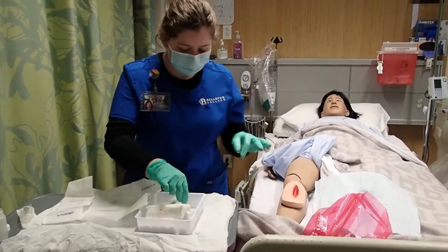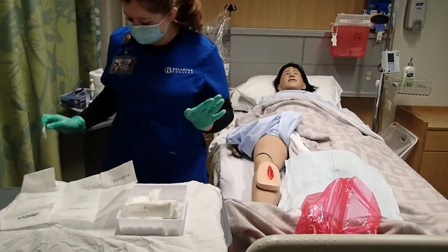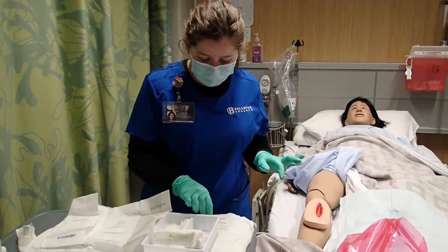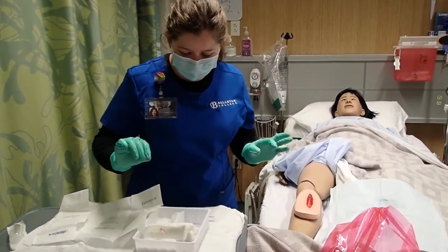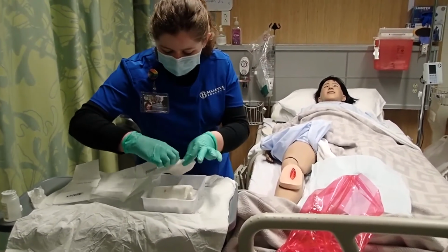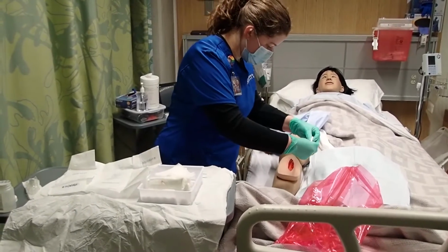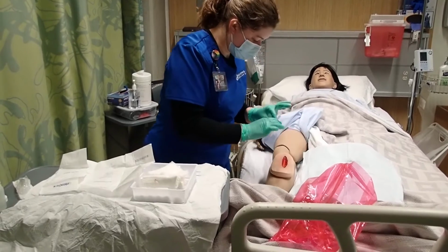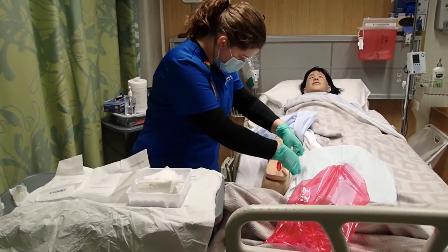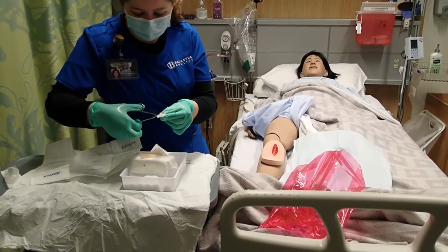One more time on the other side. And I assess the wound, and it looks better than before. And now, maintaining my sterile field, I will take some gauze, measure to size, and making sure I do not touch the healthy tissue, I will pack the wound with some gauze.